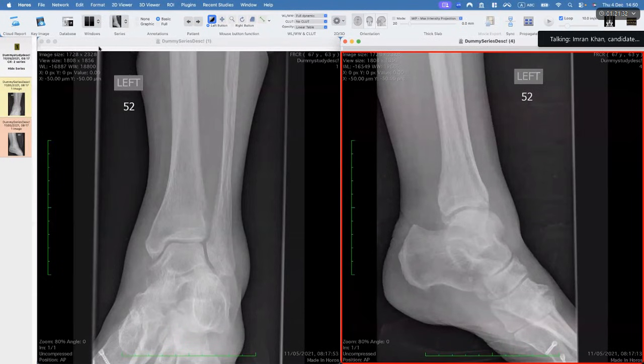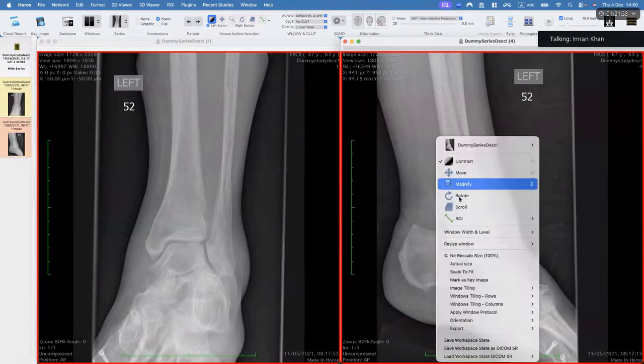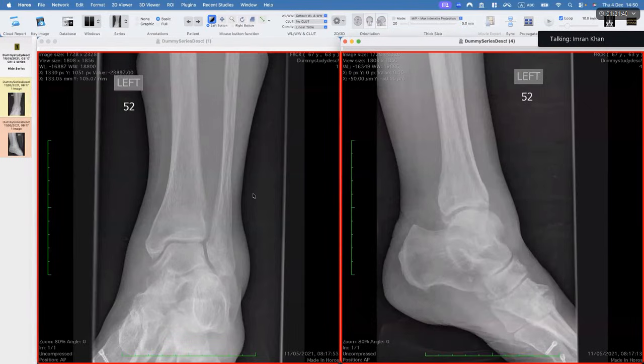She's been referred by the orthopedic team for an injection into her ankle because she is in pain. She's come in with her daughter and she's in a lot of pain, and you are about to do an ultrasound guided injection in her ankle. What do you think?